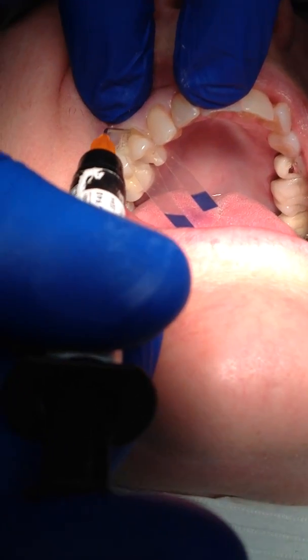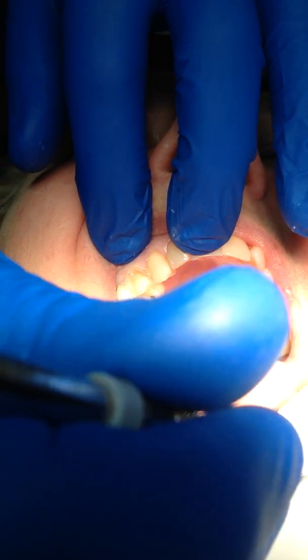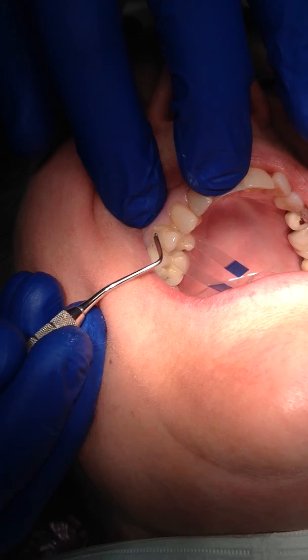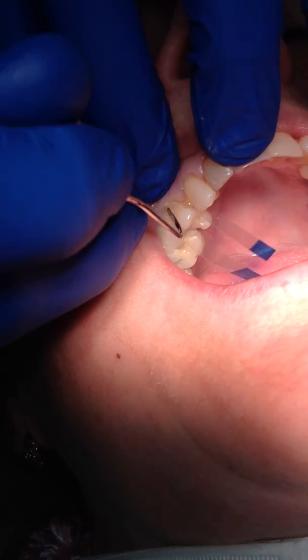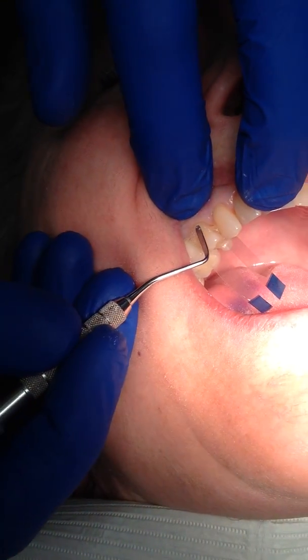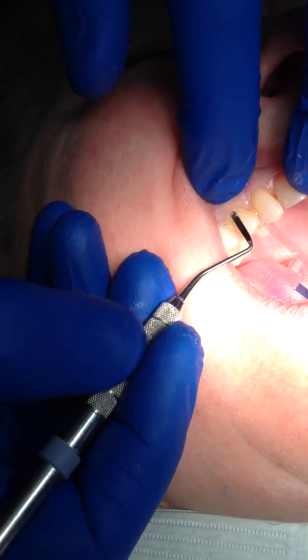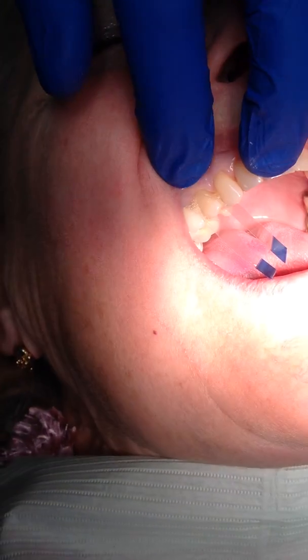One of the things that's really important is I take a little flowable resin and put just a drop in the prep. And then we take our composite — I'll show you a nice little trick with the campules at the school. We put this in, and notice as I'm pushing this in, all of the flowable resin is flowing up to the top of the tooth. There's some flowable resin still at the bottom, but it's filling in any little idiosyncrasies so we do not get any voids. When I put this in, I take my little cord packer and flatten it against the facial aspect of the tooth. And then we cure it.